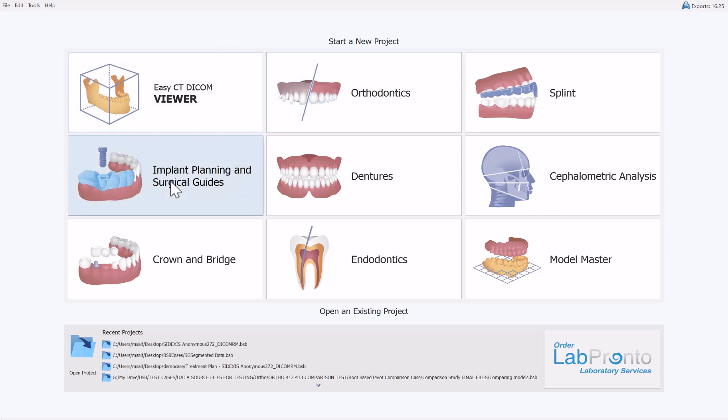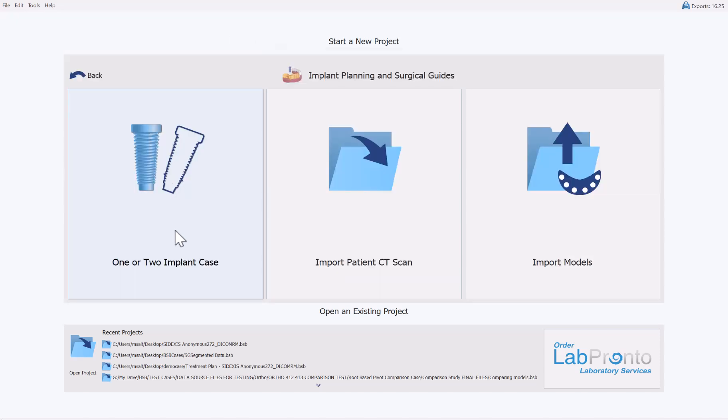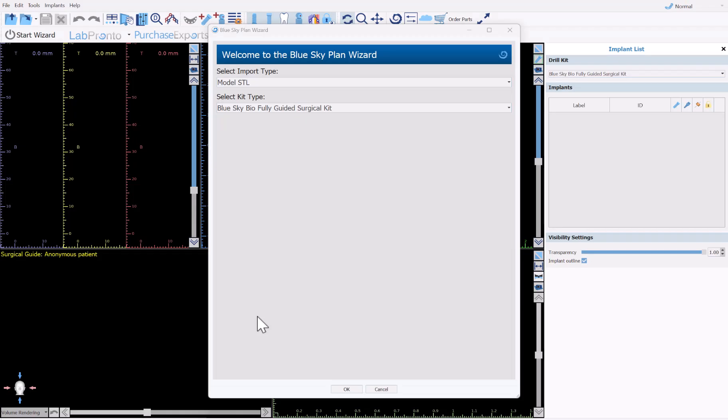We're going to start the process by clicking on Implant Planning and Surgical Guides, and we're going to select the option for a one or two implant case. I'm demonstrating using the wizard process flow, but if you're using normal or advanced mode that's fine — once the treatment planning is done and you have that automatic tooth inside the treatment plan, you'll be able to convert it into the crown very easily the same way.